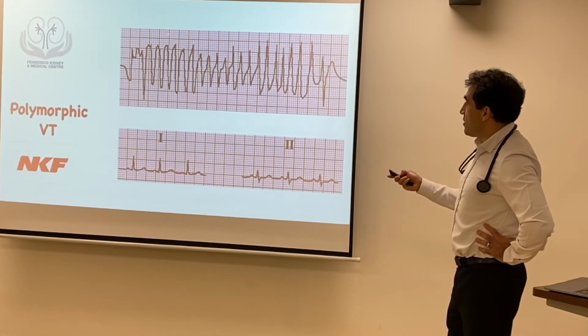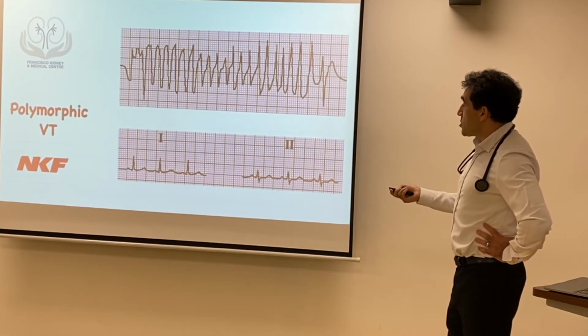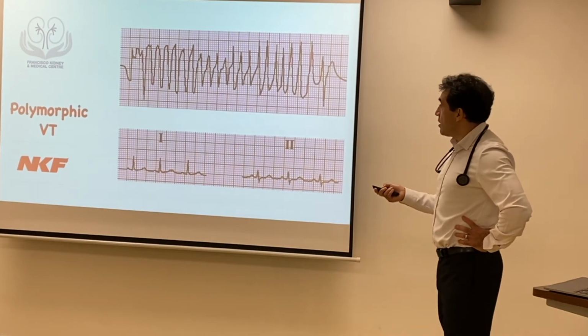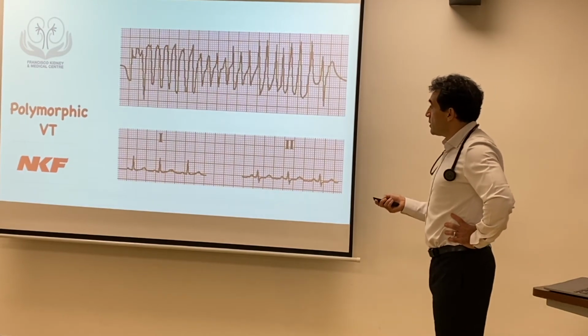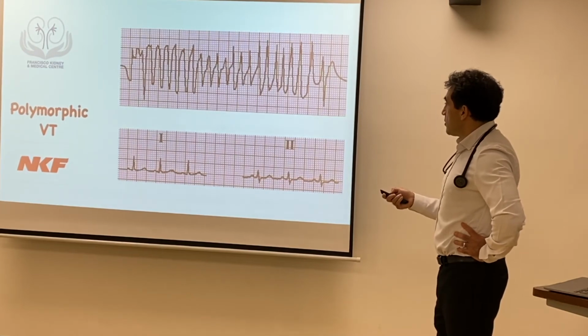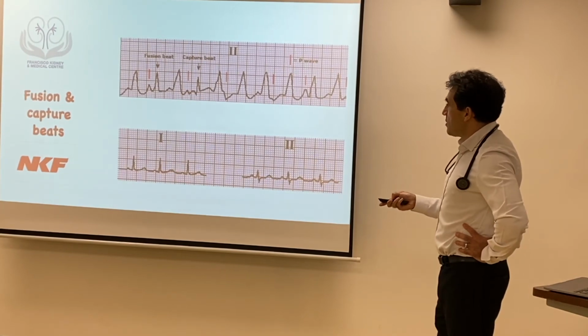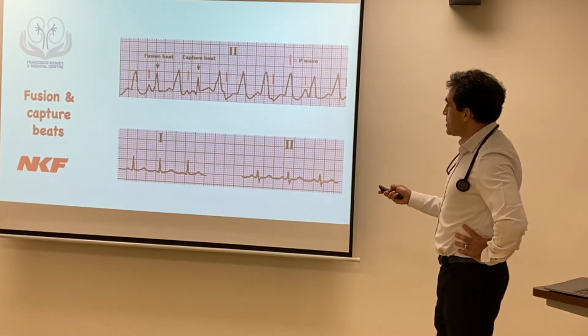This is polymorphic ventricular tachycardia. It looks totally different. It looks very irregular, and the morphology is also varying. These are the fusion and capture beats.